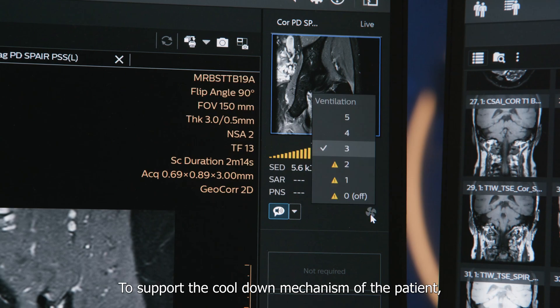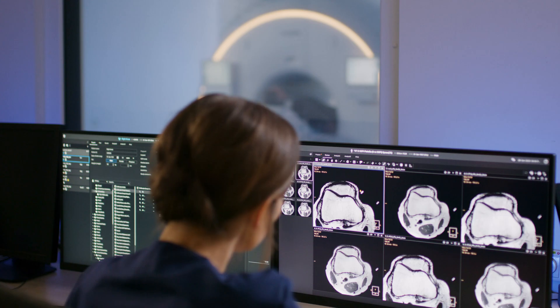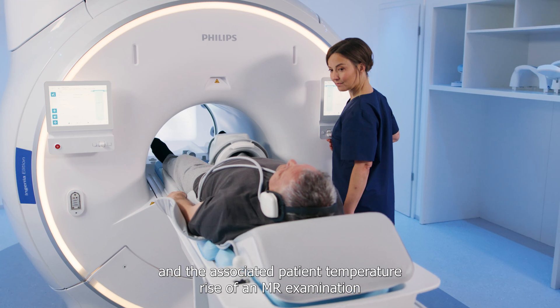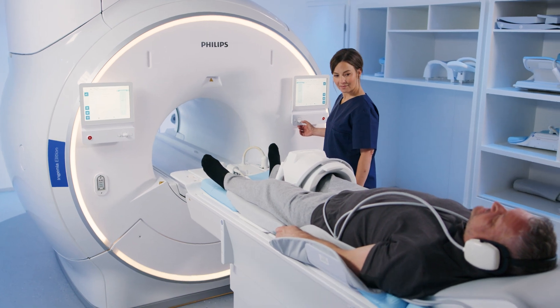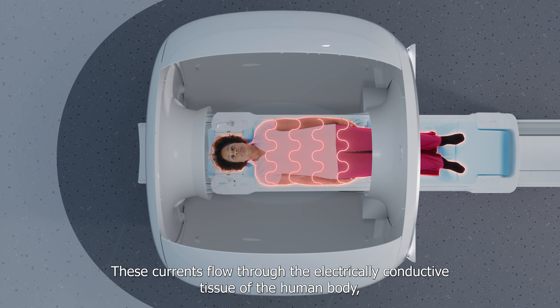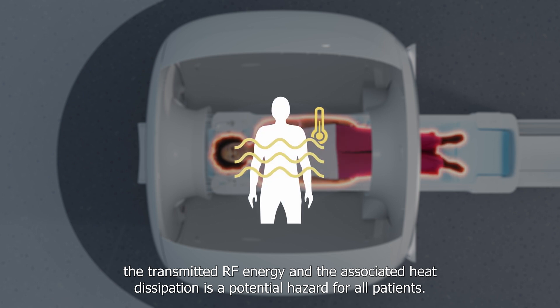To support the cool-down mechanism of the patient, set the patient ventilation at the maximum level when scanning high SAR sequences greater than 2 watts per kilogram. It should be noted that the thermal load and the associated patient temperature rise of an MR examination is a separate phenomenon from local RF energy-related thermal injuries or burns. The transmitted RF field results in the induction of electrical currents in the body, which flow through electrically conductive tissue, resulting in heat dissipation. The transmitted RF energy and associated heat dissipation is a potential hazard for all patients.